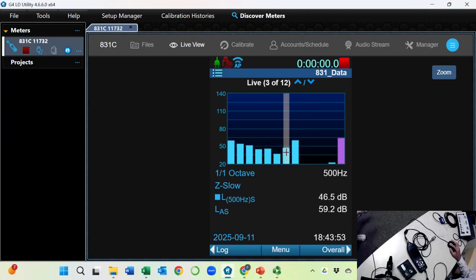On the left is 500 Hertz, 250, 125. Oh, cut in half. See that? Whenever I go to the next bar, the frequency doubles. 125, the next one I know is 250. The next one, I know it's 500.